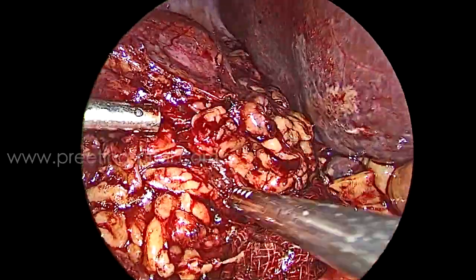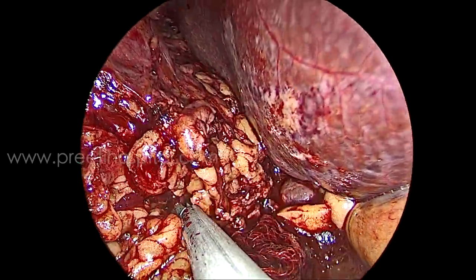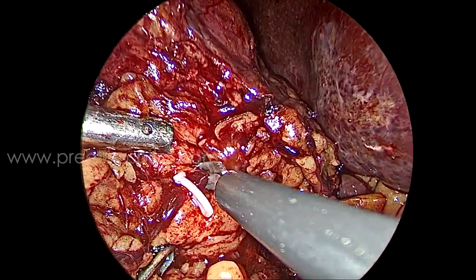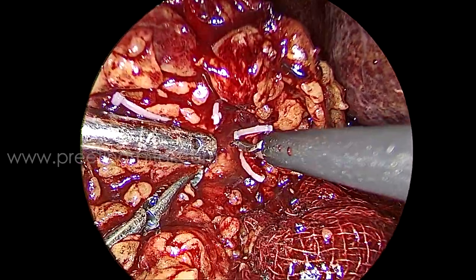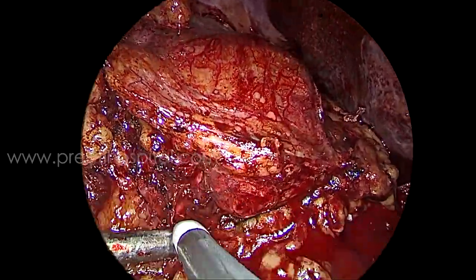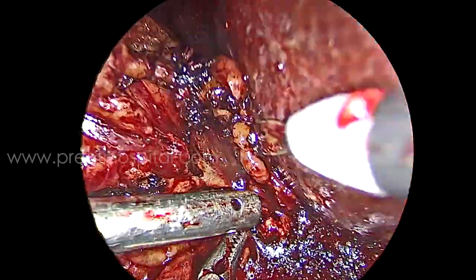The entire purpose of this video: on CT, if you observe the fat thickness is more than two centimeters — see the veins, how big the veins in the fat are, close to the hilum. We cannot really identify where the vein is going; if opened it will ooze. The tumor is on the isthmic region, the most inferior aspect — the middle part of the kidney. We are still struggling to reach the capsule.